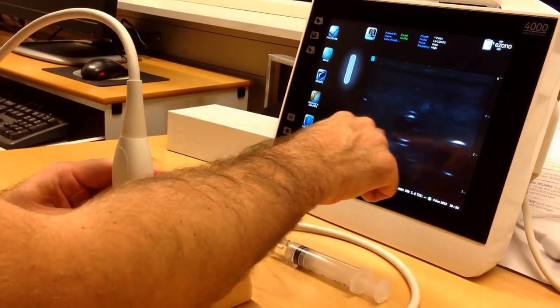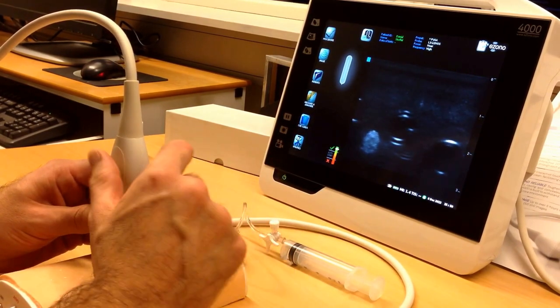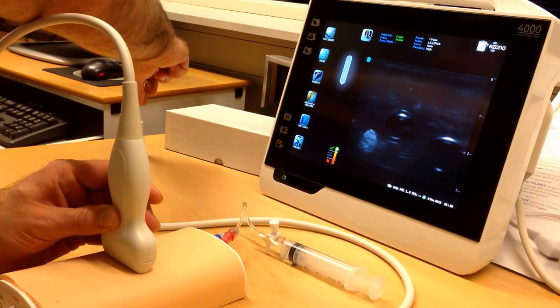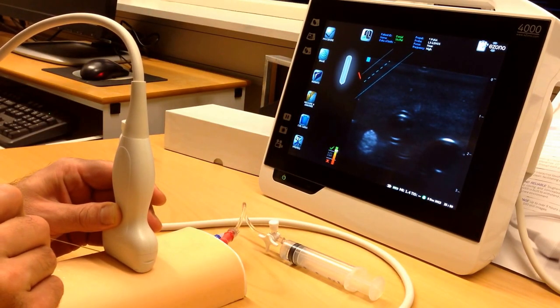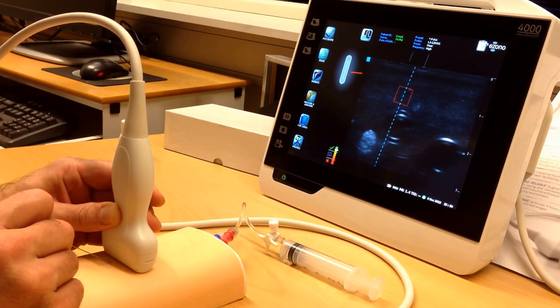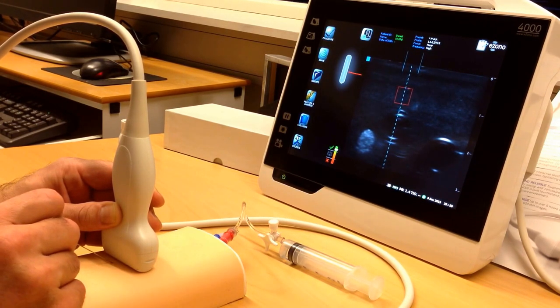Here I have now maybe a nerve, maybe this is a vein, and I'm going to use this one to target first. I'm going to use the out-of-plane technique. Here is my needle in the magnetizer from eSono, and I'm going to come close to the probe and go on the skin now. The trajectory guide shows me the direction I have to go in to find the vein.